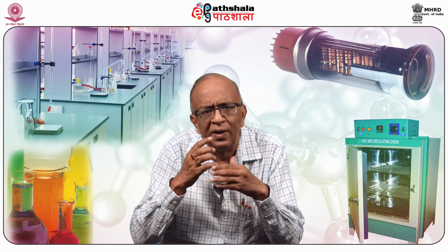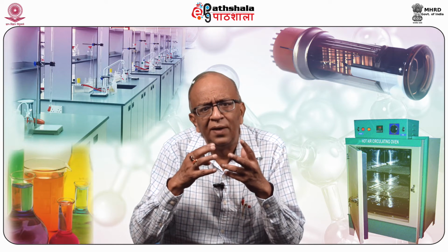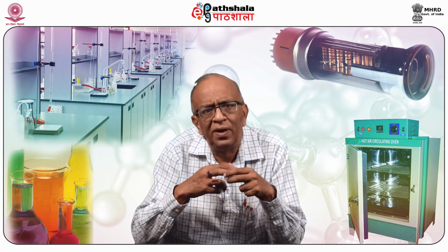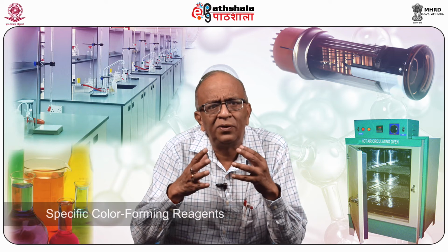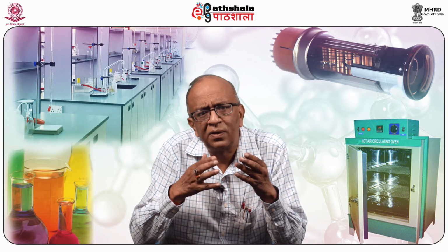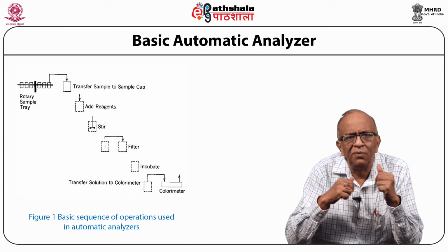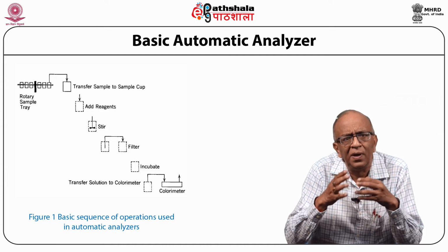The need to analyze a large number of samples in clinical laboratories has resulted in renewed interest in the development of automatic analyzers. However, these instruments generally have many things in common. Specific color forming reagents and analysis steps are carried out sequentially as the sample moves through the instrument. As you can see in figure 1, a number of samples are held in a rotating sample tray.